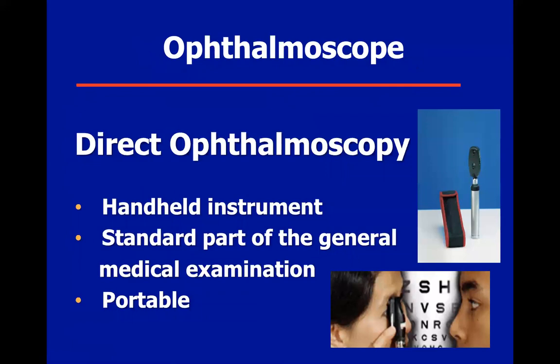Now, for you, you must know what an ophthalmoscope is. Please learn to use it. It's not because you're going to be an ophthalmologist. An ophthalmoscope is an important instrument that in every specialty you go into, you have to be able to master. I remember that I bought my own as a student because I would carry it with me, and any chance that I could examine an eye, I would do it. It's a handheld instrument, a really very important part of any general medical examination. Nothing to do with ophthalmology, so learn it.